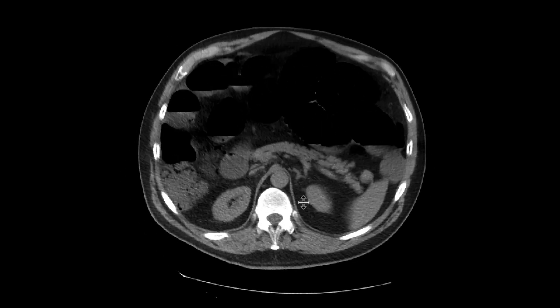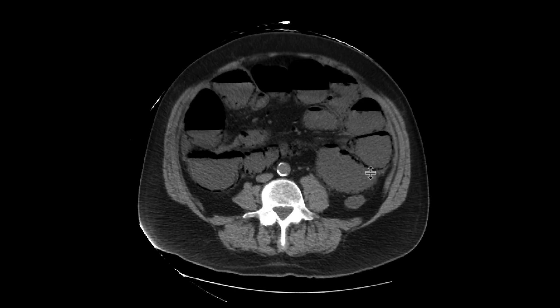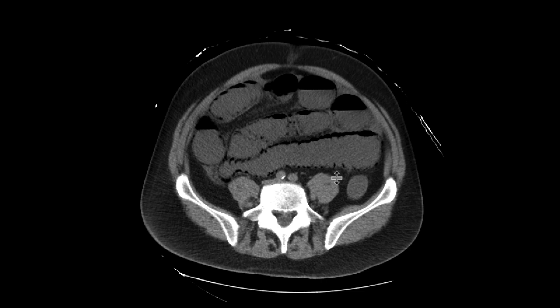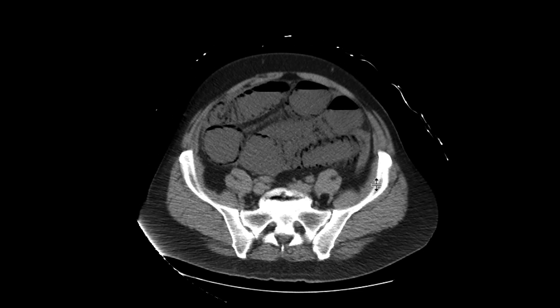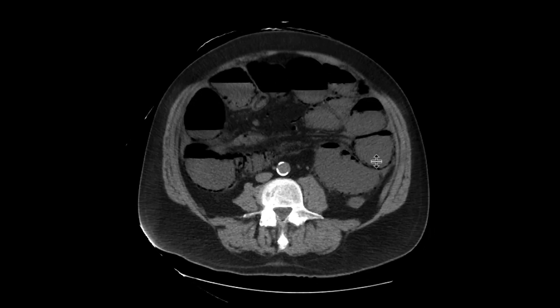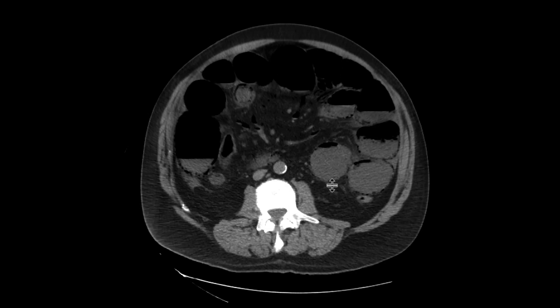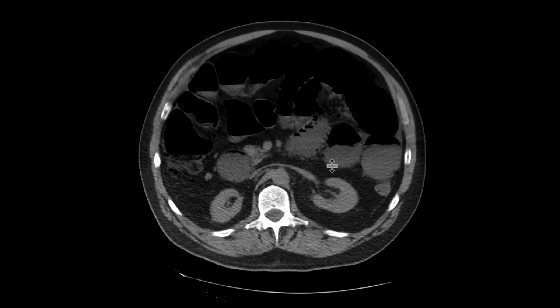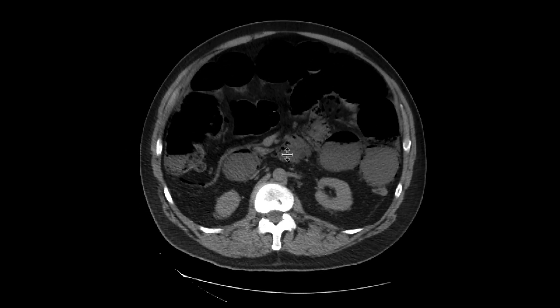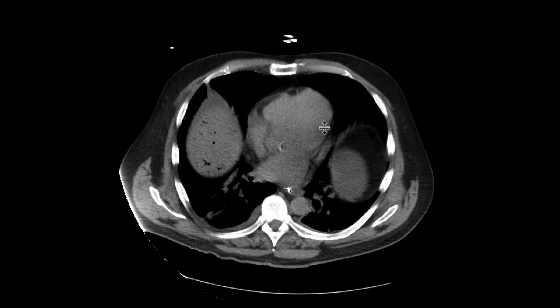If we look at loops of bowel over here, the small bowel is diffusely abnormal. Look at all this pneumatosis and gas in the bowel wall, especially along a dependent surface — it's quite extensive in this case. We can also see some of that gas extending into the mesenteric vasculature, which then continues and joins the portal vein, leading to the portal venous gas.